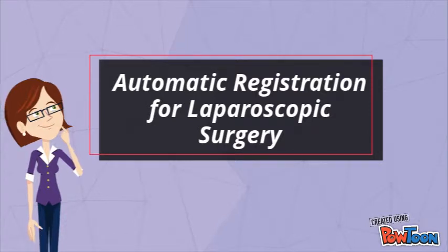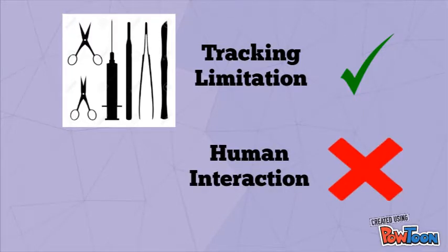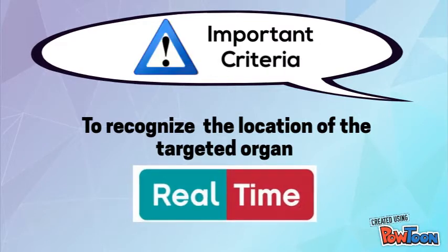Automatic registration for laparoscopic surgery. The concept of automatic registration. The surgical tool's tracking limitation is solved, and human interaction is not required. The most important criterion for automatic registration is to recognize the location of the targeted organ in real time.